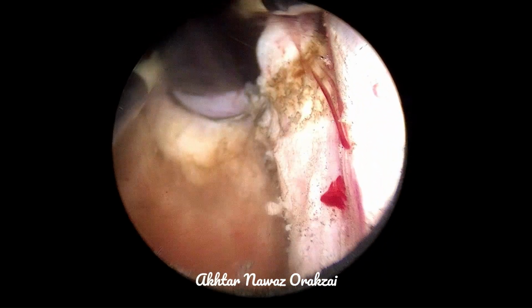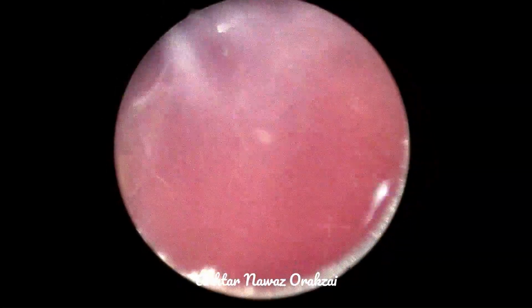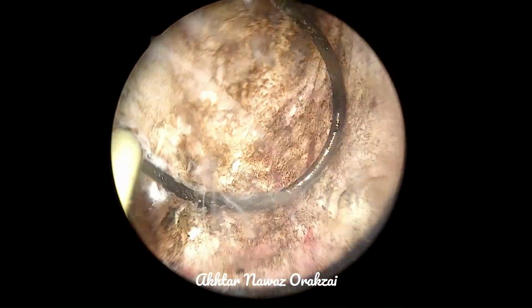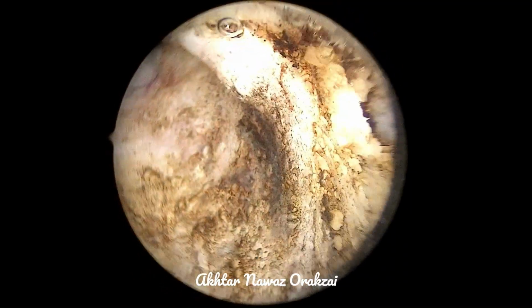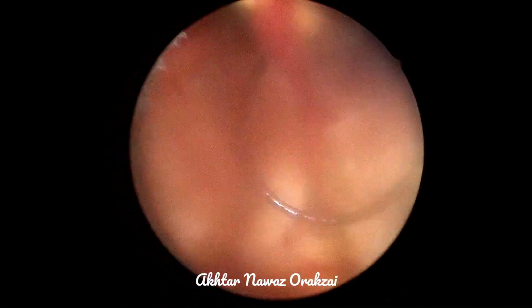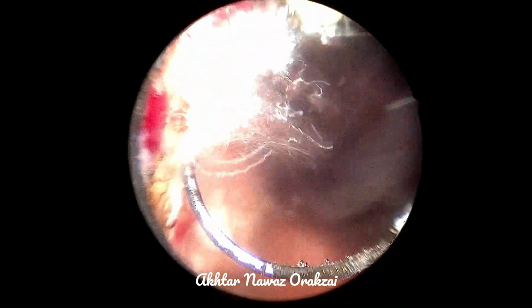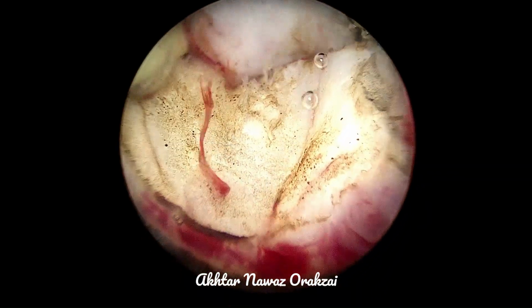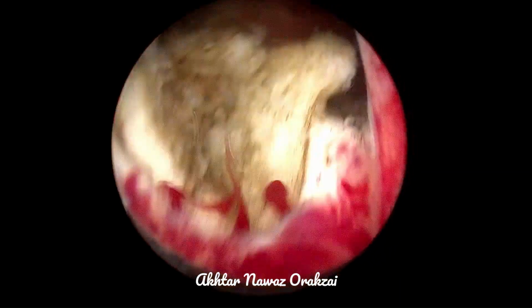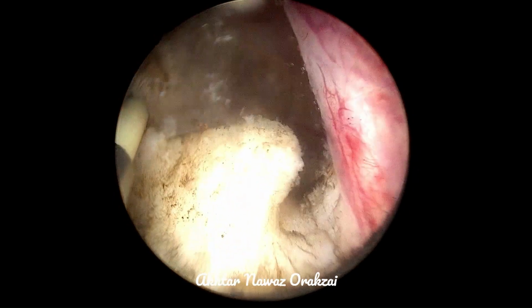Number two, you can see the bladder neck fibers. We will try to preserve as much of the bladder neck fibers as possible so that he doesn't have a retrograde ejaculation as well. As the bladder neck fibers are not contributing towards the obstruction, that will be the second reason not to resect them, and it will also help in some bit of continence of the patient. So preserving bladder neck fibers does have advantages.